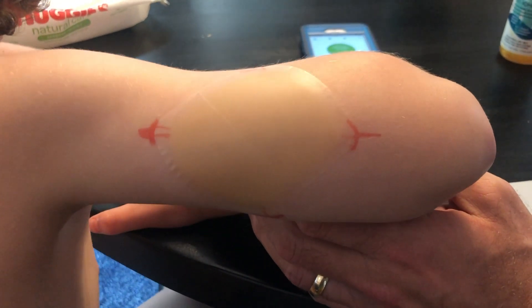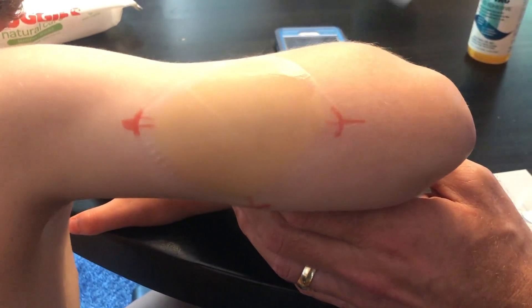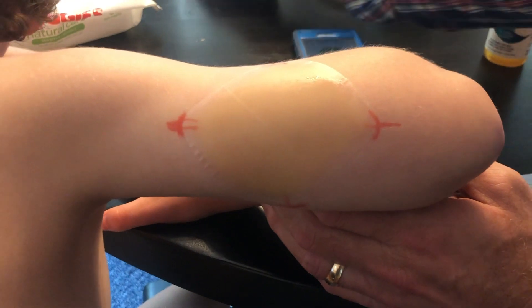Now that it's on and I've had my hand on it, I wipe it down with alcohol again to make sure that part is totally sterile.